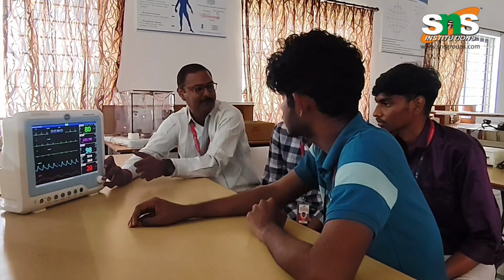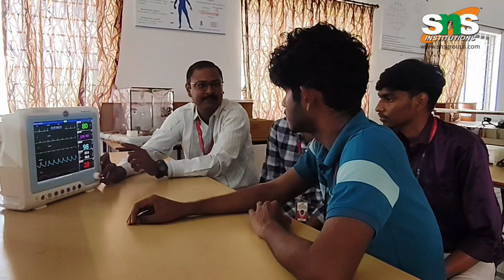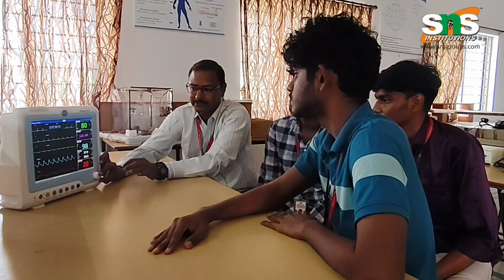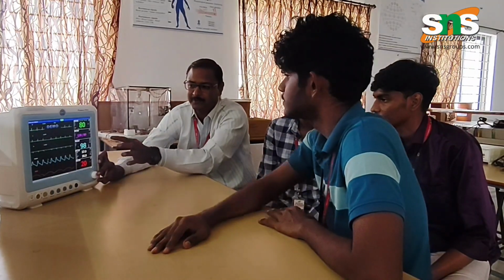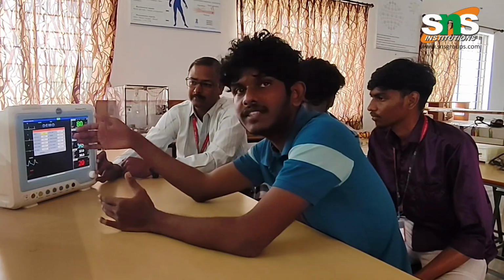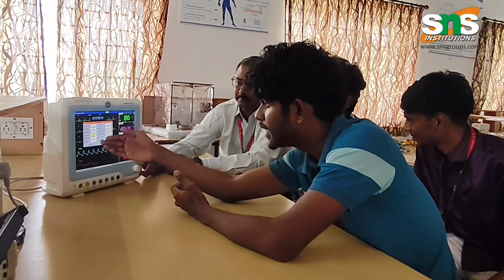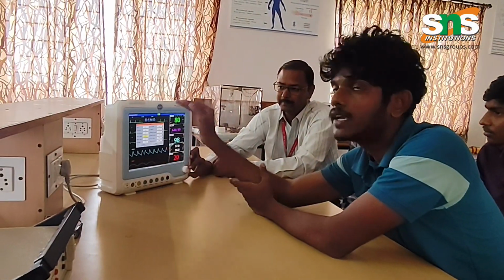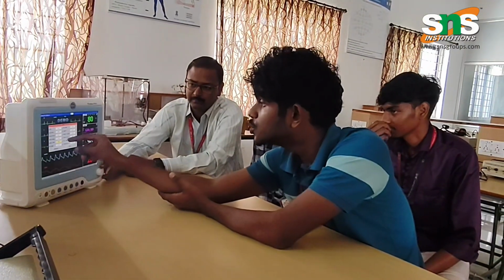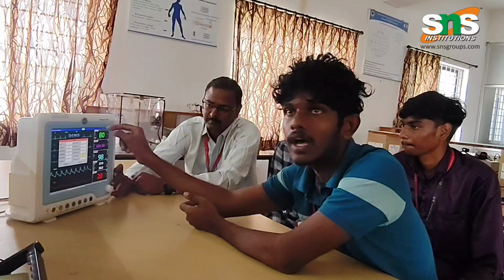Next, what is SpO2? Saturated. Yes, it is the blood oxygen saturation level. It is also an important parameter to be monitored in the critical care unit. Could you further explain what SpO2 is and what the normal range is? Yes, sir. If we come to the SpO2, we have the same options as before. The alarm is there, and we have the SpO2 high level, low level, and PR high. If it goes beyond 100, it is danger, and if it goes below 90, it is still danger. So we set the marks as 100 for high and 90 for low. If the value crosses these, the alarm will start ringing.